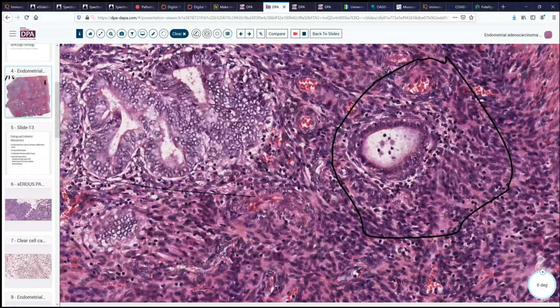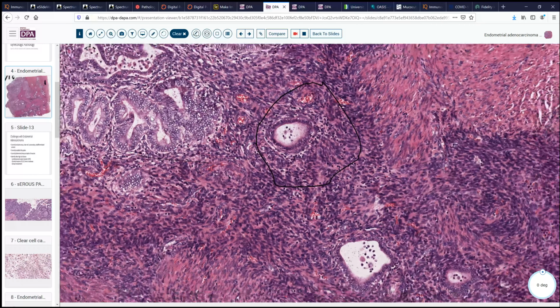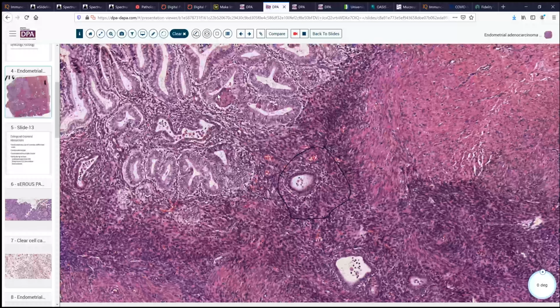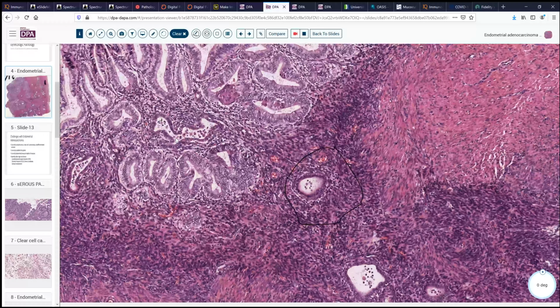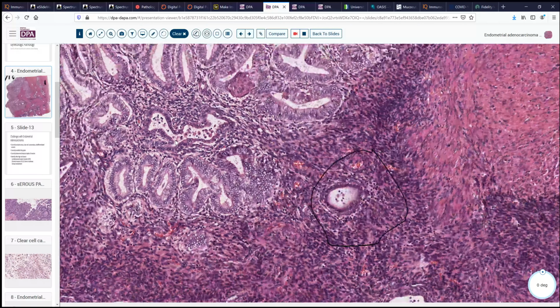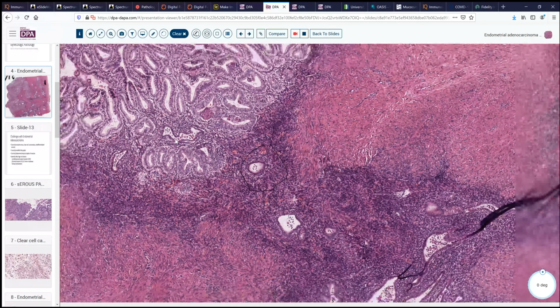They have sort of a vacuolar or vesicular change to the nucleus. The cells are much larger. There's a little bit more disarray, and these look like the glands that we had up on the surface. In addition, we see the squamous metaplasia here, and we see some intraluminal desquamative cells or debris forming here as well. Well, what's to explain this?